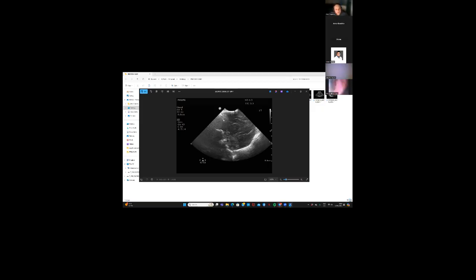It's a very good attempt. Sometimes it's the probe along with the baby moving that creates the problems. For me, at least, what it shows is there's no major significant IVH. And parenchymally, that left side, just the flare, we have to keep an eye out on.